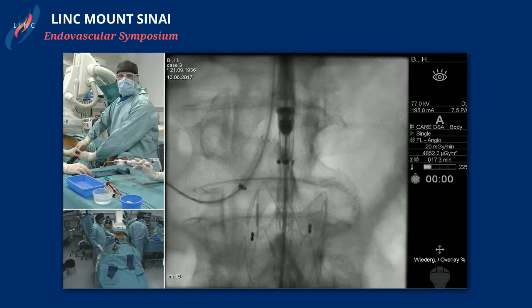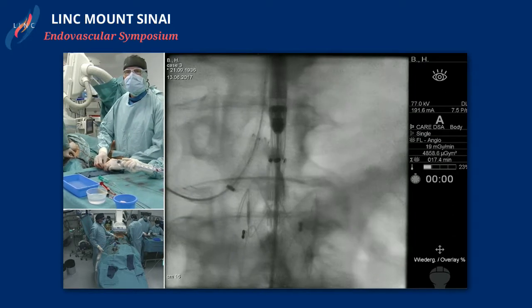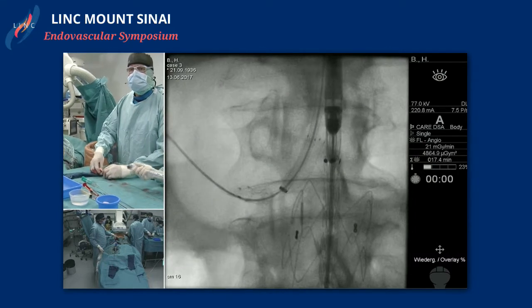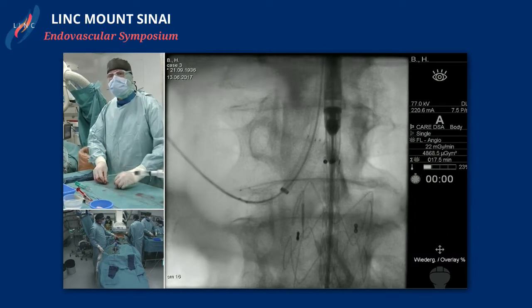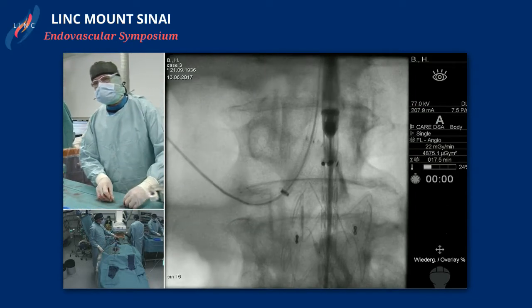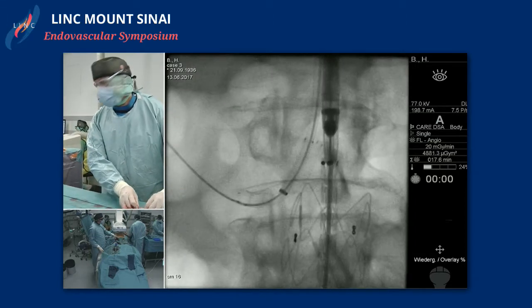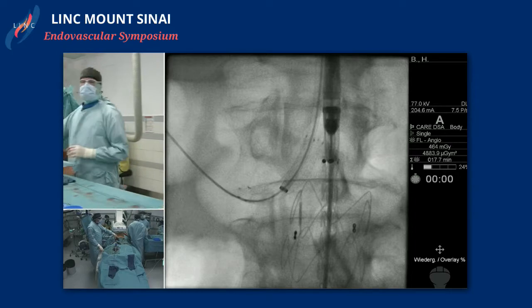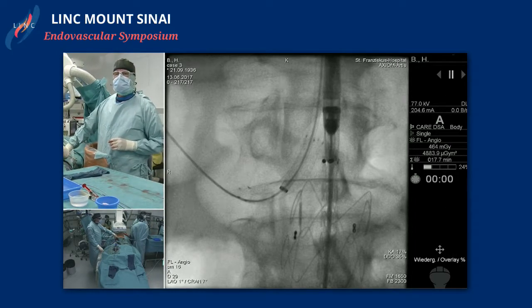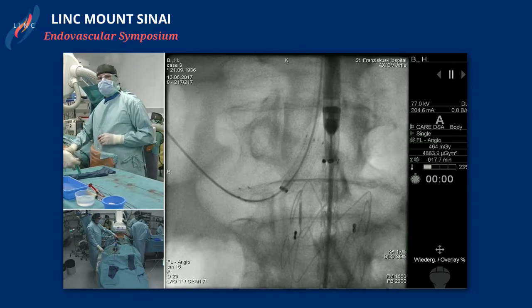To your point, we always do the opposite, so I withdraw. For the balloon mounted, we feel free to deploy without the aortic endograft in place. But for the self-expanding, we always deploy the aortic graft first because they're so flimsy. Especially if you're in an aneurysmal segment, they'll really drop and you can lose everything. They'll collapse, they'll change their length, they'll go to the other side. They do all sorts of things if they're not pinned by something else, especially if you're in a big sac. Here they're in a normal segment of aorta and a little more constrained.